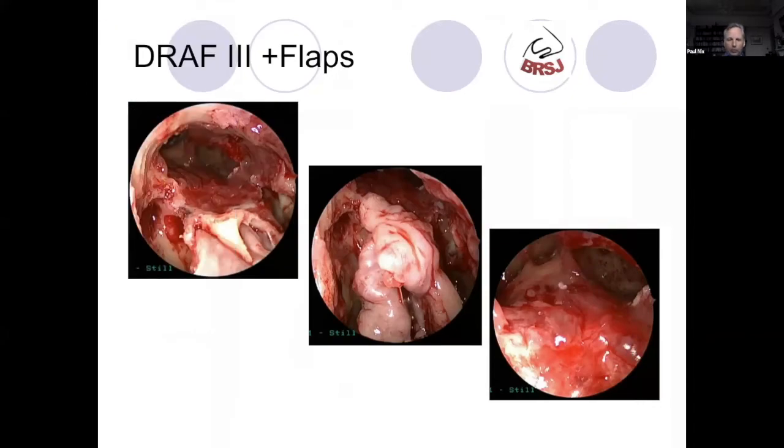After we finish the procedure, we've got all that flap material. Now, in reality, not all of it stays intact. And if it does become free, you can use it as a free graft. Basically, wanting to put mucosa over any of the exposed bone which we've made in our dissection. If it's free tissue, then I'll glue it in place.